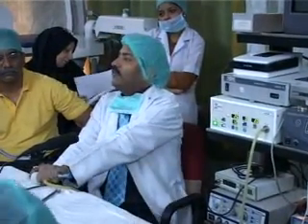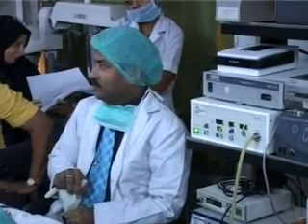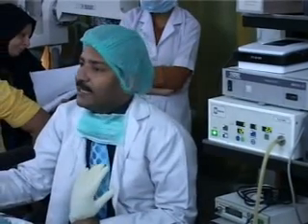And the insufflator will give you 5 seconds to correct your problem. It will give an alarm. Why does it give an alarm? Why does it not immediately withdraw the gas?